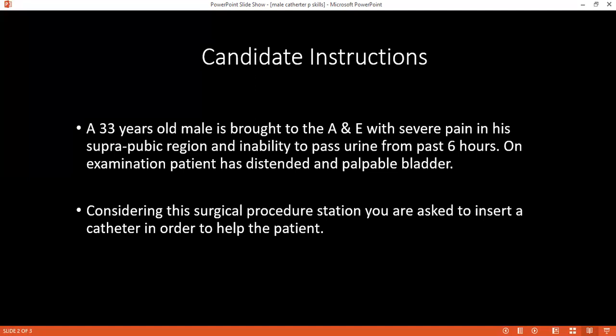Then I'll check the patient identity by checking the bracelet of the patient, and I'll check the WHO checklist. Okay. Mr. Smith, do you have any allergies? No, not that I know of. Okay. Are you on any medications? No. Okay. Now, if the patient has a vital chart, I'll check the vital chart. Mr. Smith, we'll be having a chaperone with me for assistance. Is that okay with you? Yes, available. Okay.